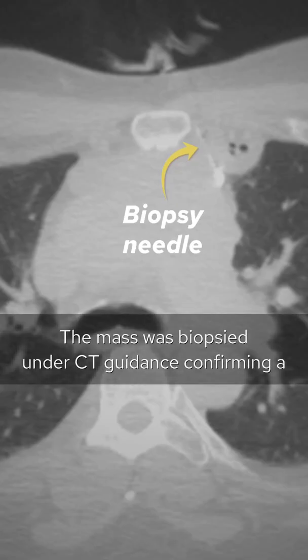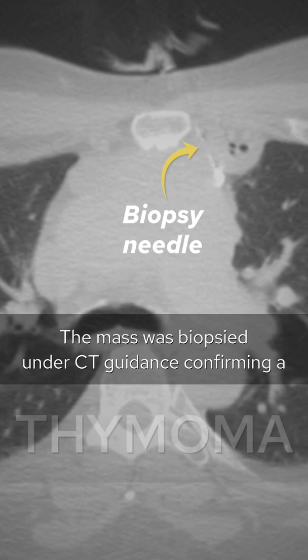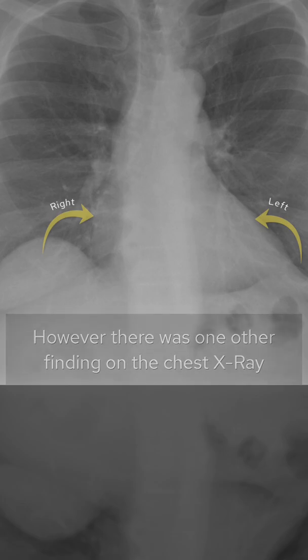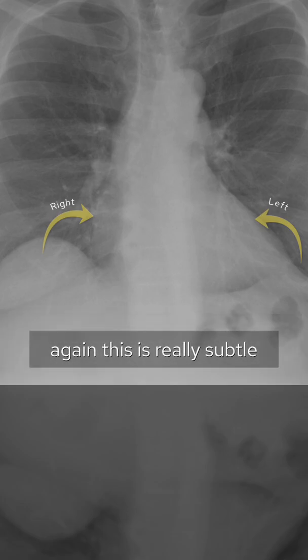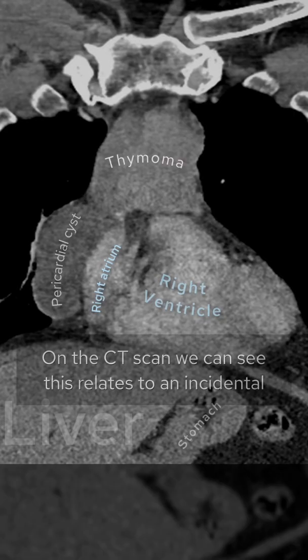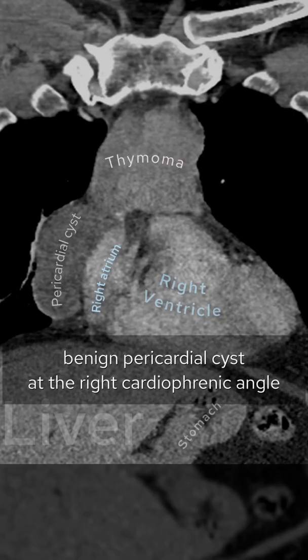The mass was biopsied under CT guidance, confirming a thymoma. However, there was one other finding on the chest x-ray — again, this is really subtle. The right side of the heart is less dense than the left. On the CT scan we can see this relates to an incidental benign pericardial cyst at the right cardiophrenic angle.